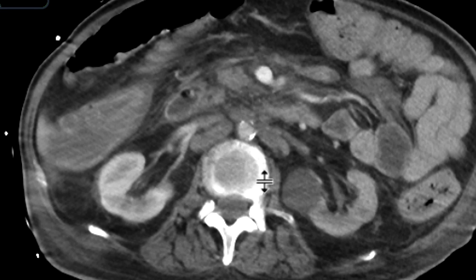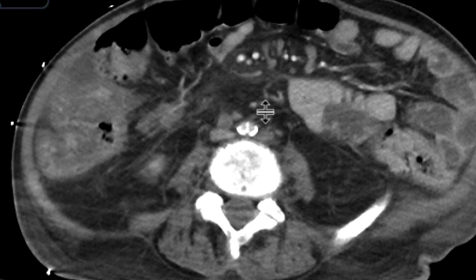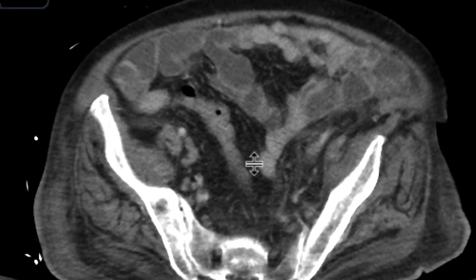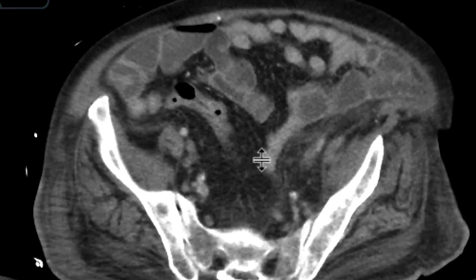We can start to see some adenopathy both in the retroperitoneum and within the mesentery, a little bit of mesenteric stranding. There's a little bit of fluid down in the pelvis as well.